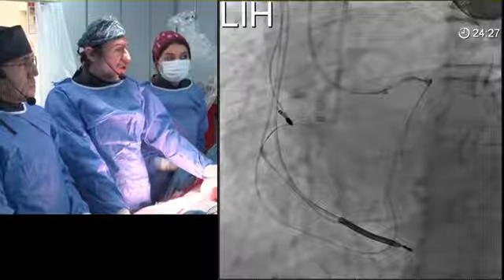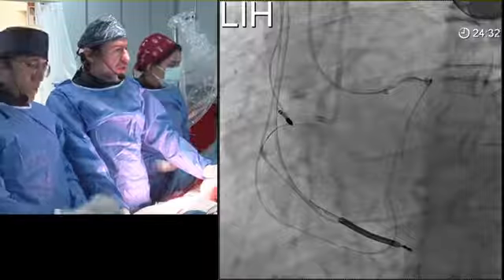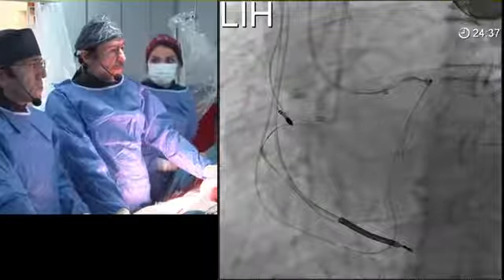I agree with the femoral approach, but the problem here is this: we couldn't discontinue the oral anticoagulation, and it was the only patient that we had for today. So therefore, I didn't want to go femoral. And I was very fast here, so this is still an option. Maybe I will put a wire into the femoral artery and make a very clean puncture. After 30 minutes, I try here retrogradely. And regarding the Carlino, the patient had oral anticoagulation yesterday. That's another concern for me, so it limits my options. I like doing Carlino, but it's also in my mind.